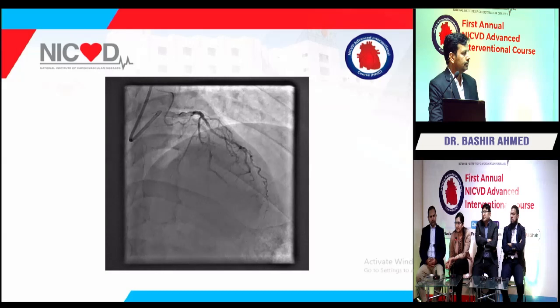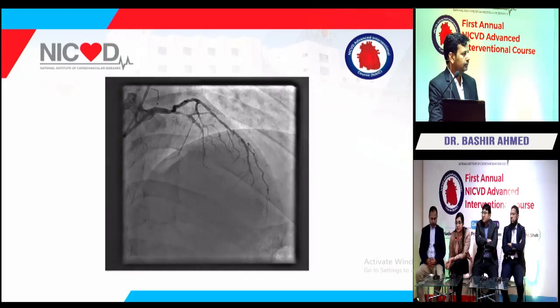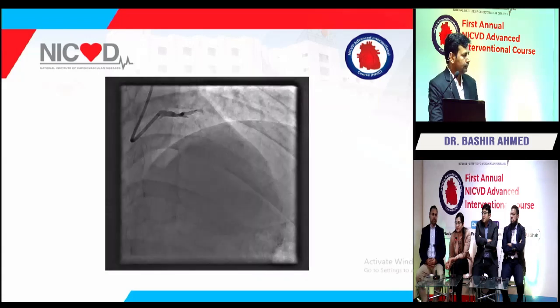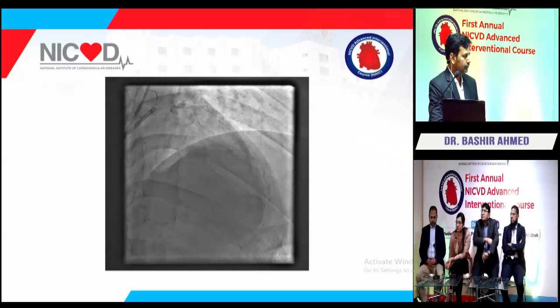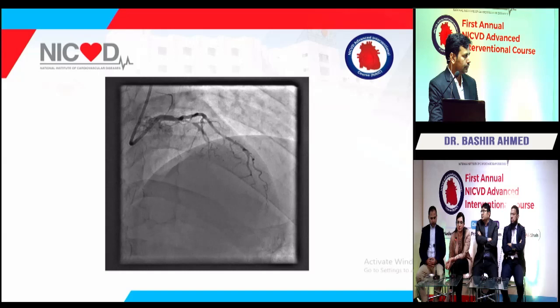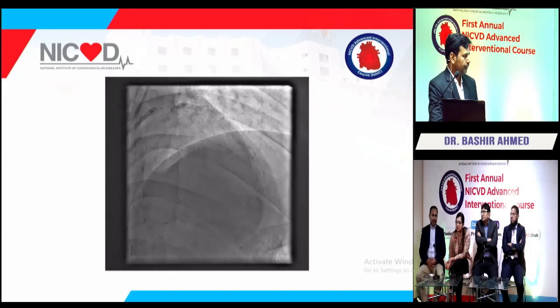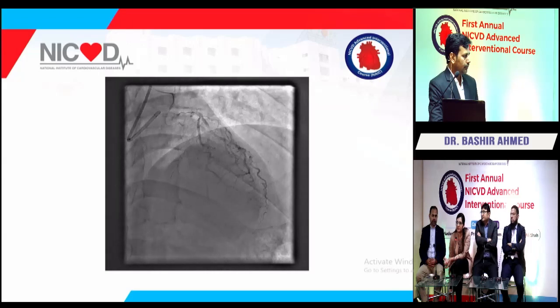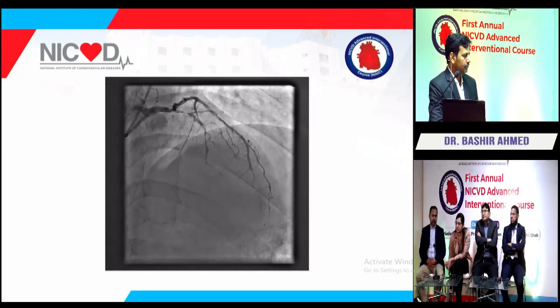In SVG grafts, rota is not performed. If you see a thrombus or a dissection, then you would not go ahead with rota ablation. You could, maybe, if you did ballooning and there was a dissection and you are still not satisfied, wait another 3-4 weeks, get the patient back on the table again and try rota. However, when you have angiographic evidence of a thrombus or dissection, you would not go for a rota ablation.